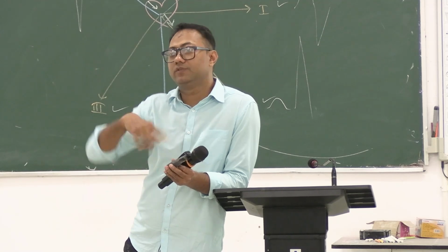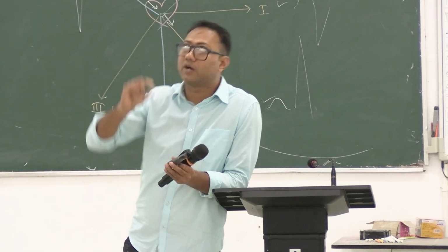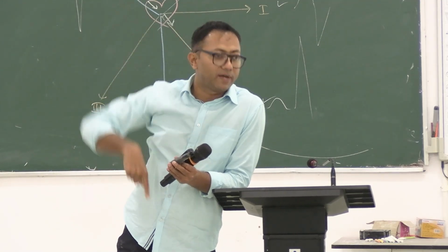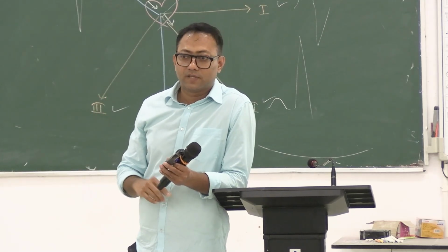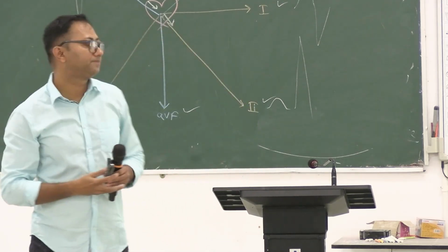If I ask you the voltage of the QRS complex, you will count the small squares on the y-axis and multiply it with 0.1 and you get the voltage. Clear?